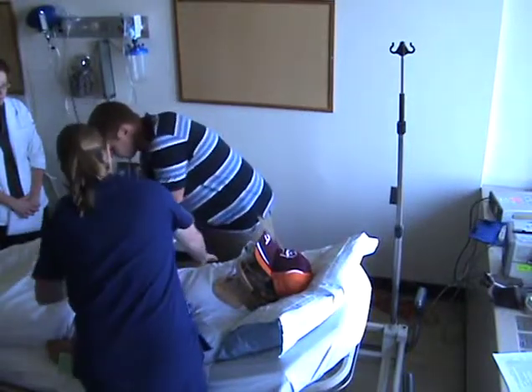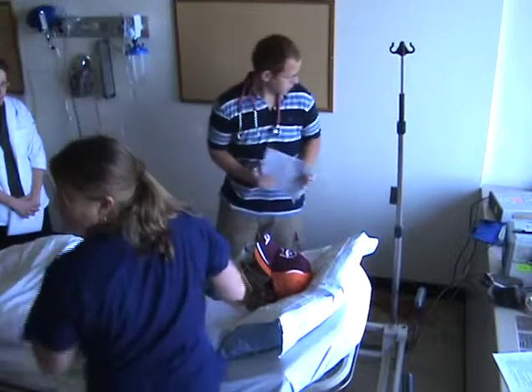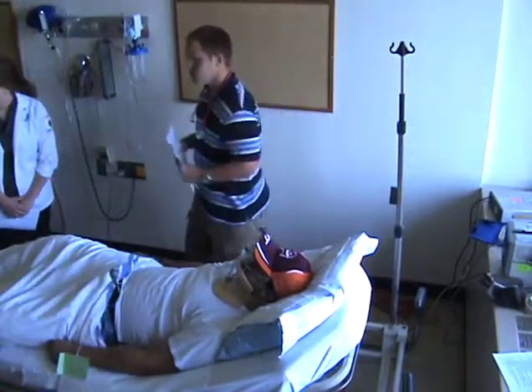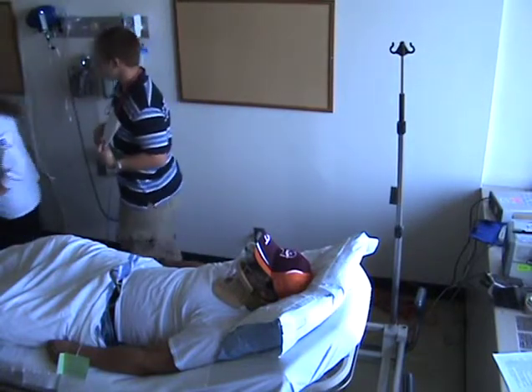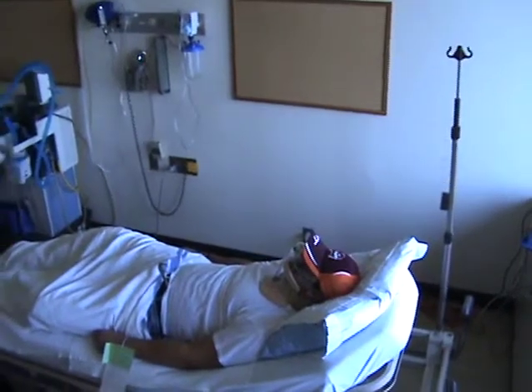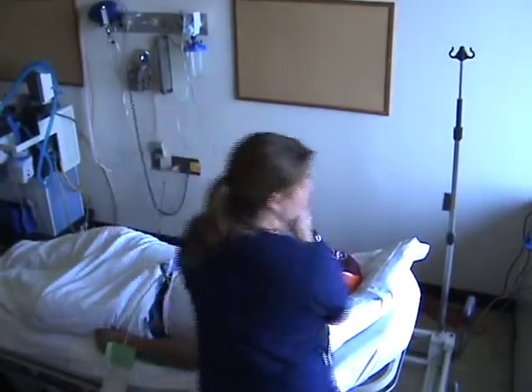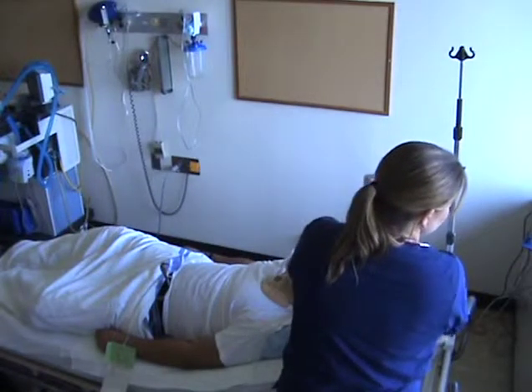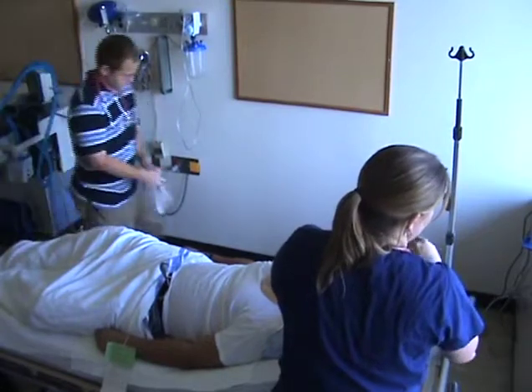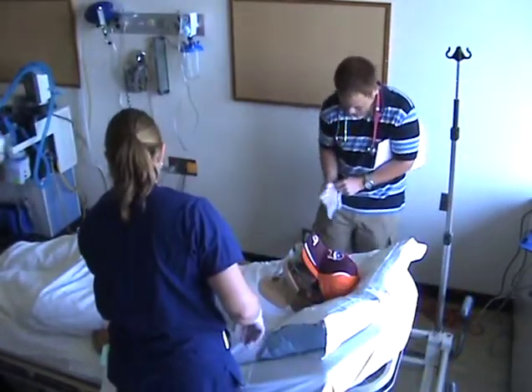He's got an open wound. Y'all want to get your gloves on. We do have gloves on the table. Okay. So you got the O2 sat monitor on. It's only reading 78%. His respirations are still very shallow, and he almost appears not to be breathing well on his own. That's turned up to 15 liters non-rebreather, and he's not really breathing well on his own, so we need to set up for intubation.